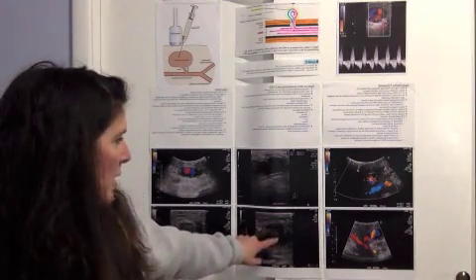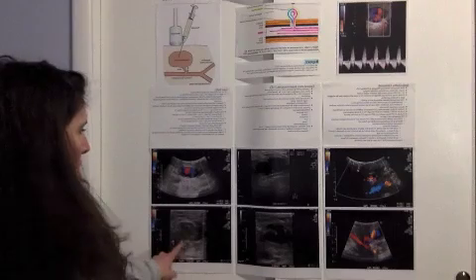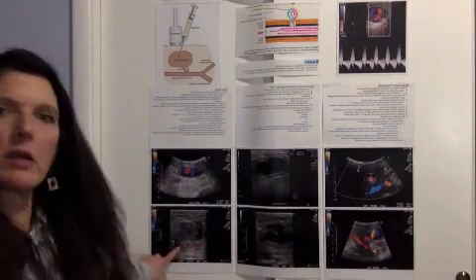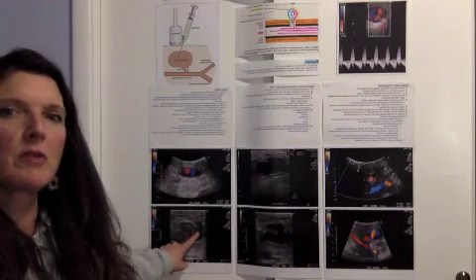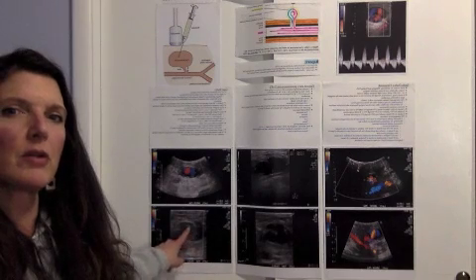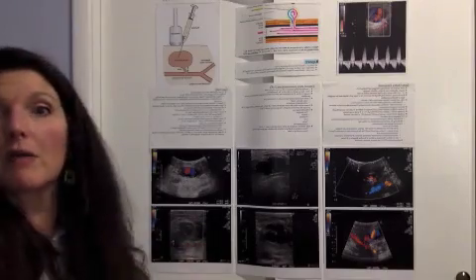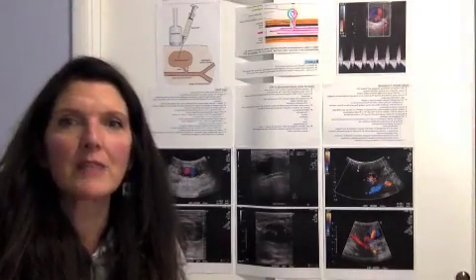We injected it and then followed that with color Doppler. You can see that there's a little bit of color here and here, but none in the lumen. If you look a little closer, you can also notice some thrombus in there. So it had immediate cessation and it was successful.